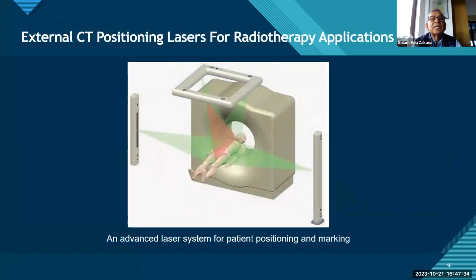And of course, here are the external lasers. This can also be checked, but it is in radiotherapy, because in radiotherapy you need the geometrical parameters very well. But in radiodiagnostic, geometrical parameters are not important. Only the field size and collimation are important, nothing else. You have only your photons.